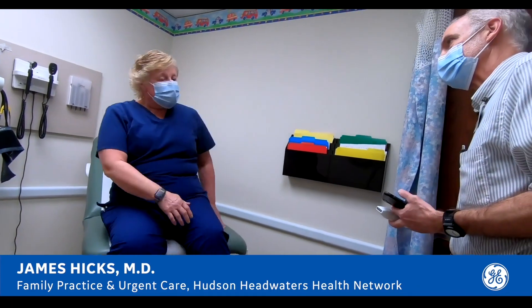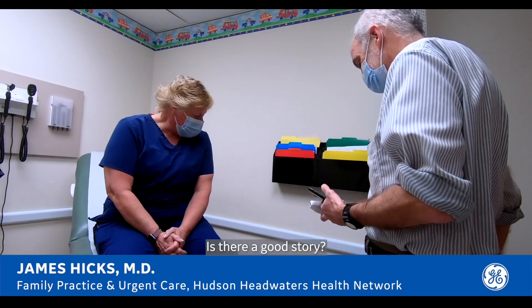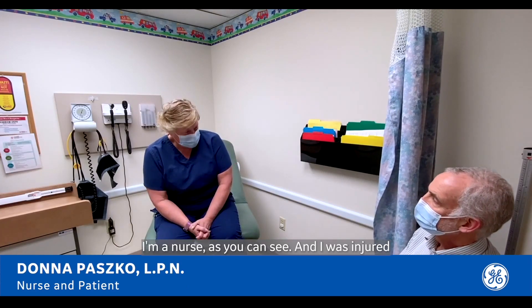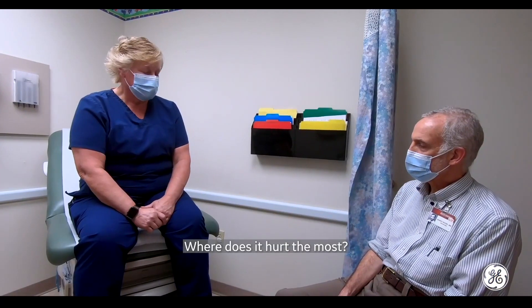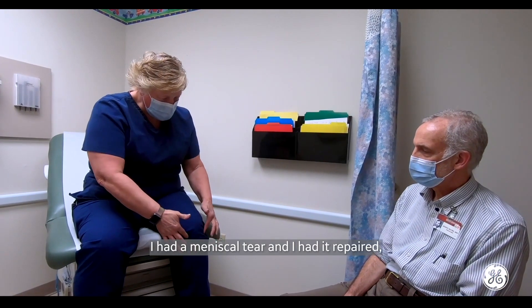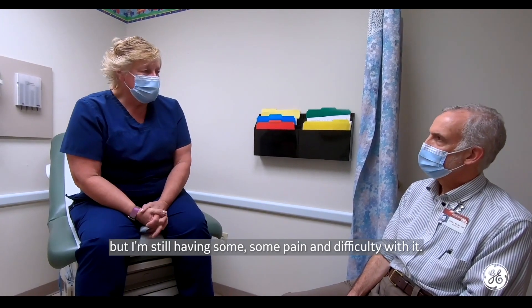How are you today? Suffering from an old injury in my history. Is there a good story? I'm a nurse, as you can see, and I was injured in the line of duty. Oh, I'm so sorry. Where does it hurt the most, Donna? I had a meniscal tear and I had it repaired, but I'm still having some pain and difficulty with it.